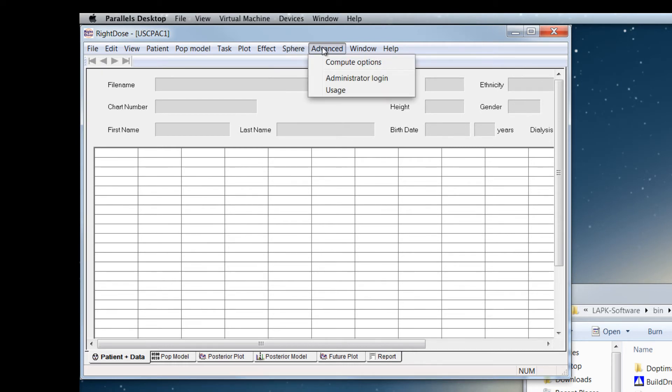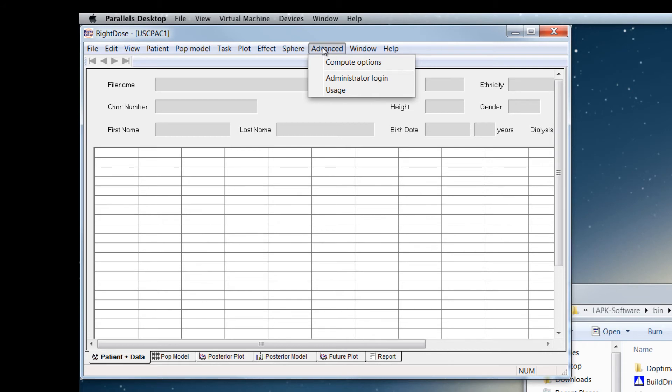Advanced gives you access to options to control different modes of fitting and optimizing doses, allowing you to switch between the straight multiple model mode, interacting multiple model mode or IMM for changing parameter values, and the hybrid Bayesian, map Bayesian MM mode to attempt to fit patients who are not well described by the model.